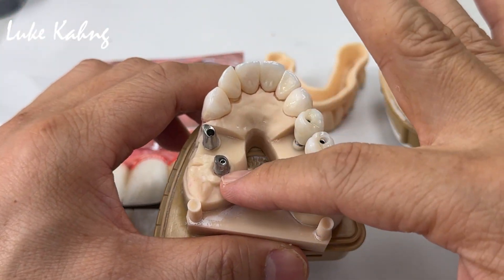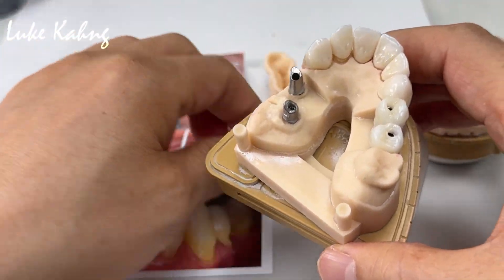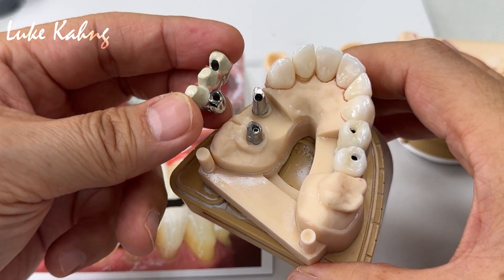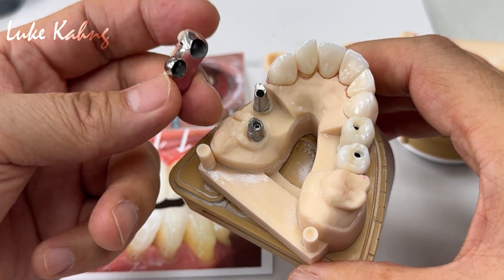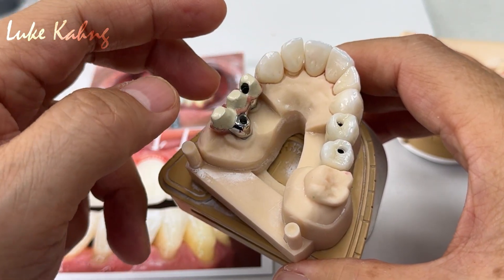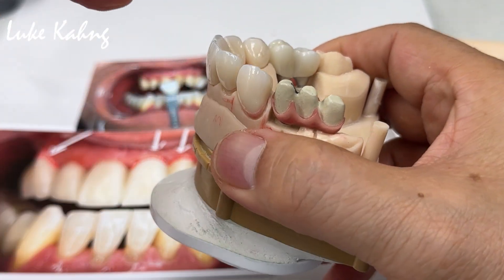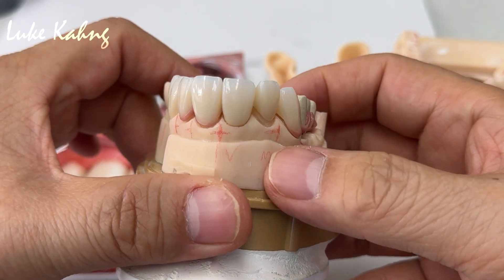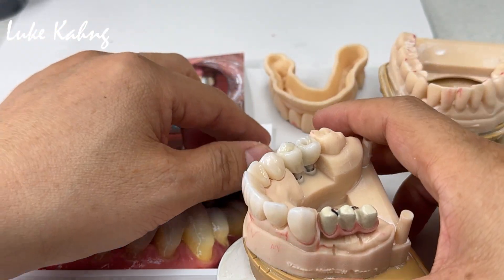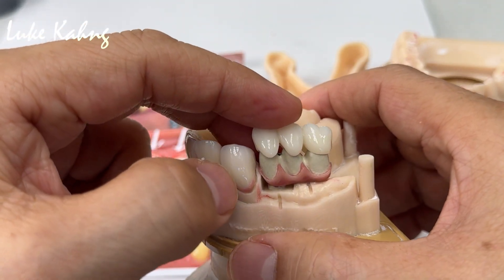The problem here was the lingual position. A 3-unit bridge alone is a little bit weaker and irregular in that situation. So we made a crown over, as seen in the previous video, making it as hygienic as possible, and cemented it on top. We also made a pink aesthetic in between the teeth — pink porcelain — and on top of that, made a monolithic 3-unit bridge. This is all monolithic, and we made it perfect.